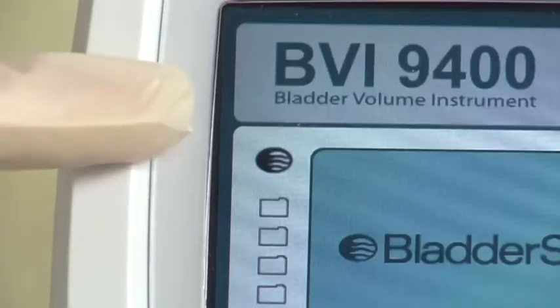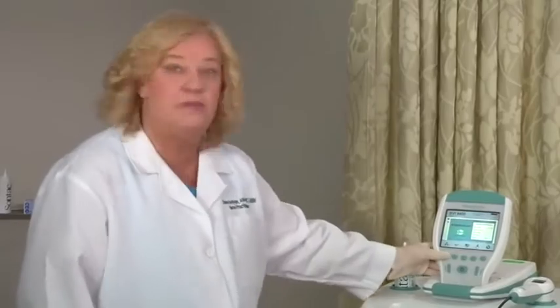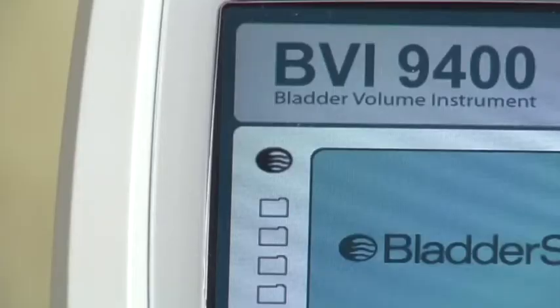A female patient who has had a hysterectomy should be scanned in the male mode. This is shown as a bladder icon. To begin, first select the proper exam mode to ensure the accuracy of your scan. Press the mode button repeatedly until the right setting appears. Select to scan a male patient or a female patient who has had a hysterectomy, a female patient who has not had a hysterectomy, or a small child under 48 inches (122 centimeters) tall and weighing less than 60 pounds or 27 kilograms.